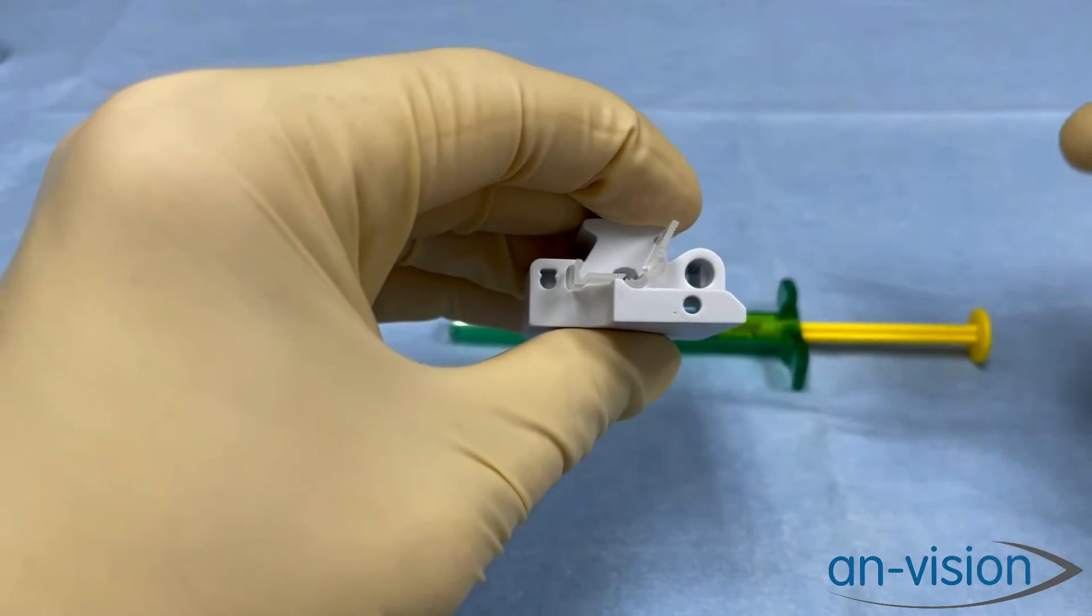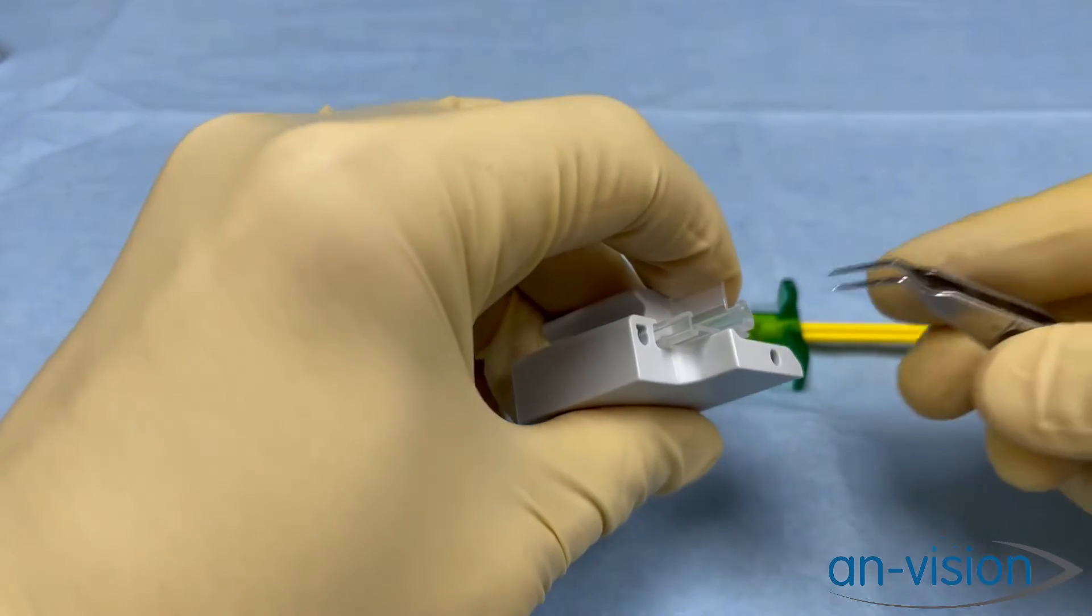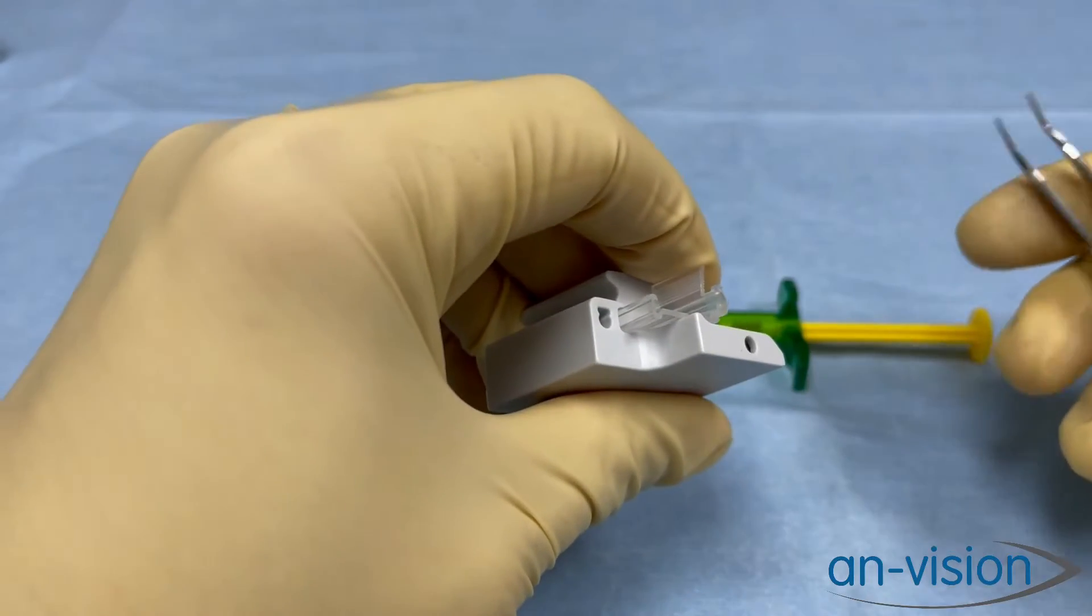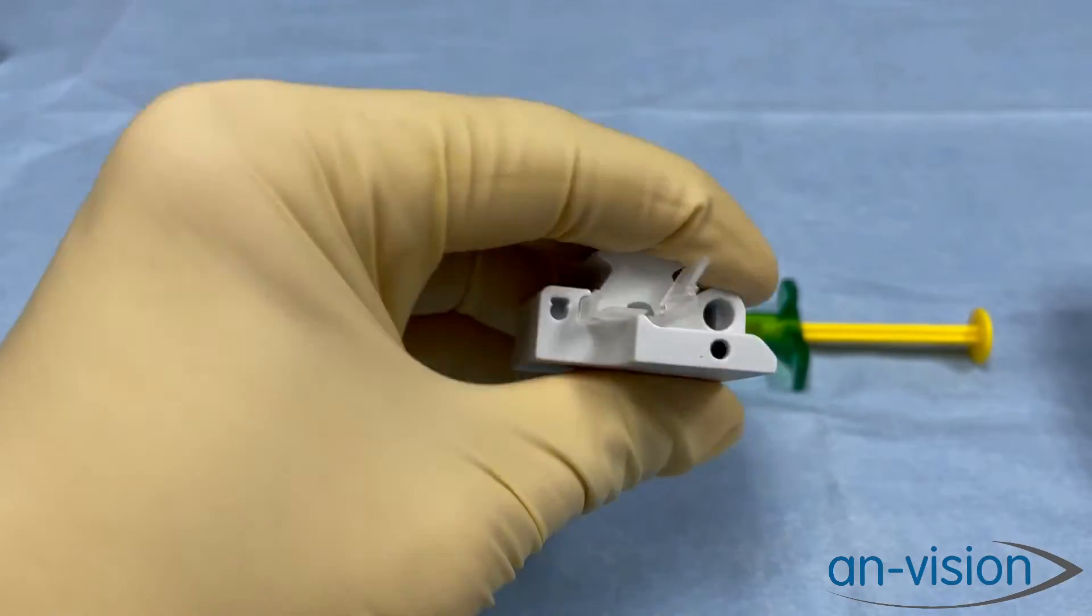so the IOL doesn't float up and become trapped between the two flaps and rip as we inject it in the eye.